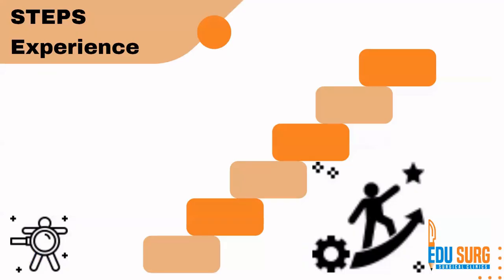So now going to a stepwise approach, like I said, it is based on experience and it is something that we have developed after seeing around 500 scans on console. And what we prefer, we are going to show. You can develop your own pattern because that is what will work the best in your own hands. Now, a very important point is when you get a scan, and if you are seeing it on a console or on the films, see the name, age, and scan date. Because often in practice, you will see that the patient may have someone else's scans. So that should not create problems in diagnosis.